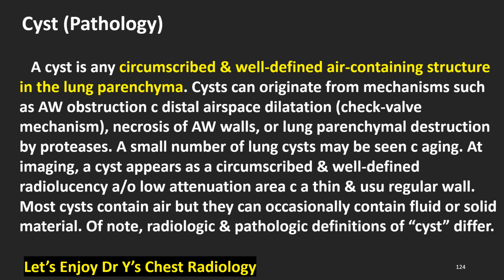At imaging, a cyst appears as a circumscribed and well-defined radiolucency and/or low attenuation area with a thin and usually regular wall. Most cysts contain air, but they can occasionally contain fluid or solid material. Of note, radiologic and pathologic definitions of cyst differ.